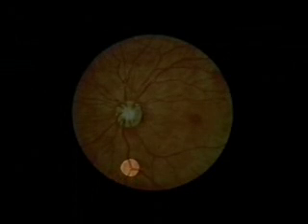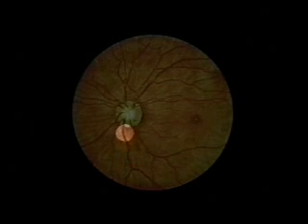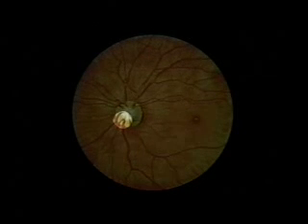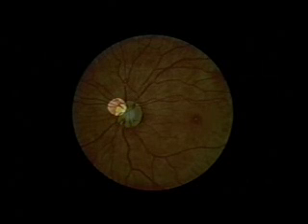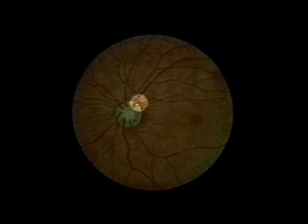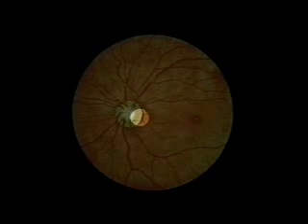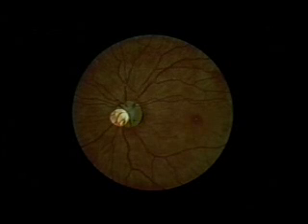Try to find the optic disc by following the retinal vessels toward the place where they converge. Now bring the optic disc into sharp focus by adjusting the ophthalmoscope lens. Note the color of the optic disc, the clarity of its margin, and the size of the physiologic cup. Normally, the disc is yellowish-orange to creamy pink and round or oval with well-demarcated margins. It may be surrounded by white or pigmented rings or crescents. The optic cup to disc ratio is usually less than 1 to 2.